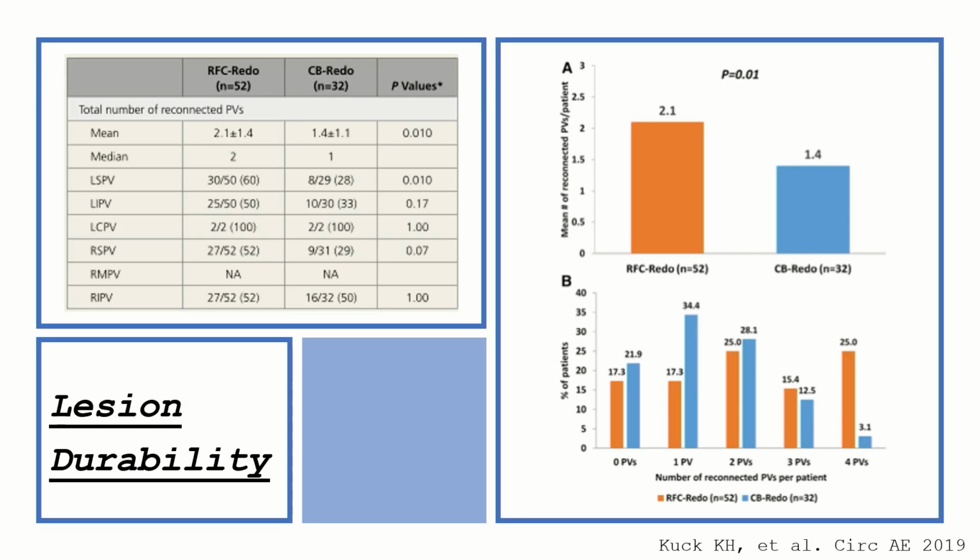Now, although we as EPs are very happy when we get these beautiful isolations at the end of the procedure, we have to always bear in mind that many of these veins will reconnect, such as you see here, again, Fire and Ice by Karl-Heinz, showing that up to two veins per patient were reconnected during redo procedures.